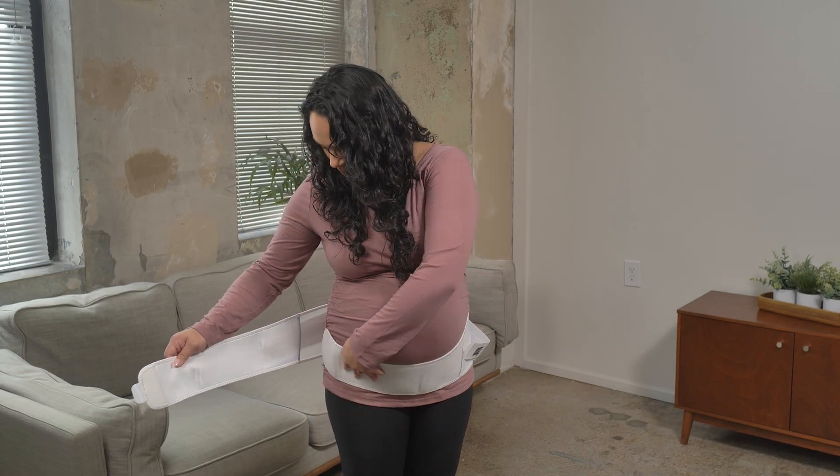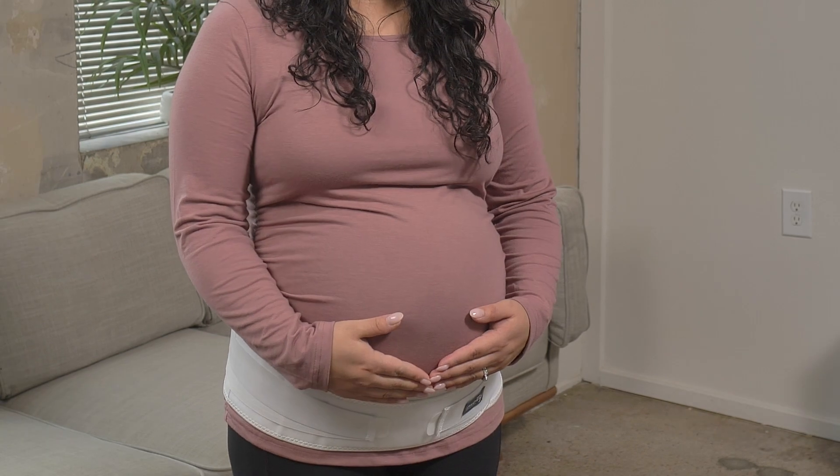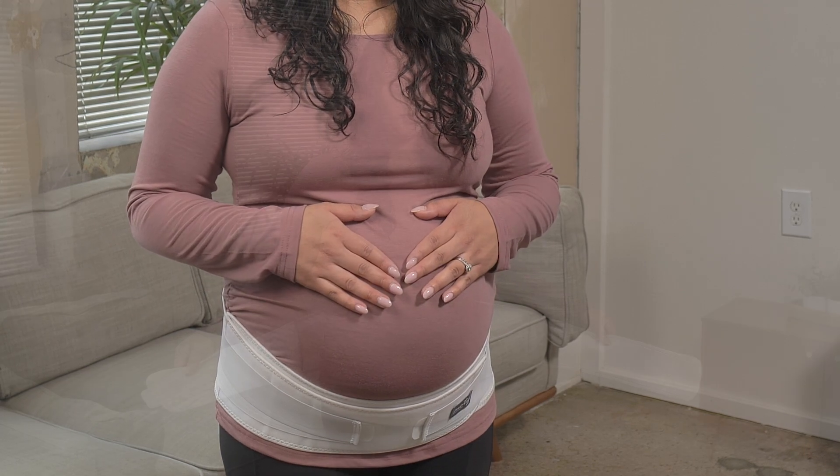Welcome to this tutorial on how to wear your pregnancy back brace from Motif Medical. This brace helps redistribute the weight of your growing baby, providing relief from pressure in your abdomen, hips, and lower back. Let's get started.